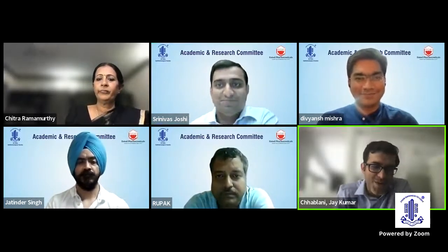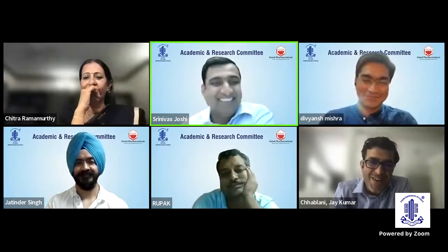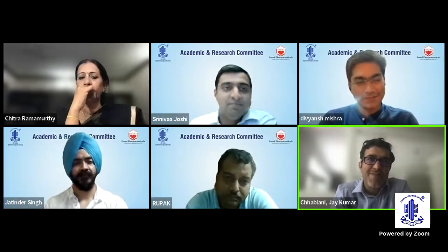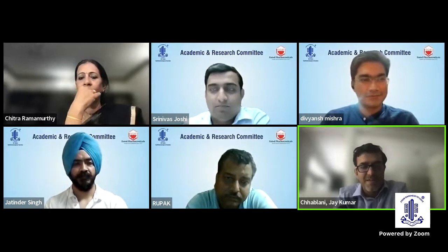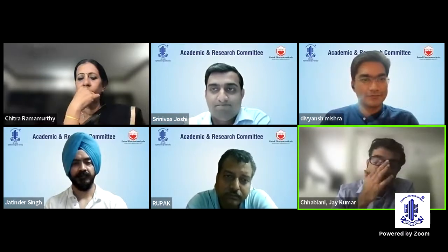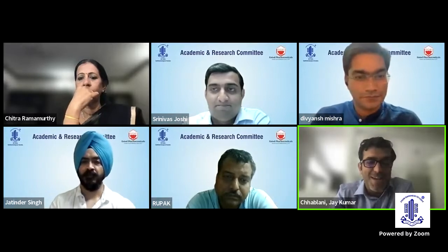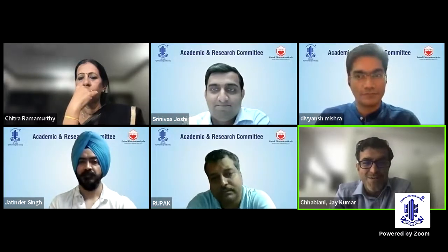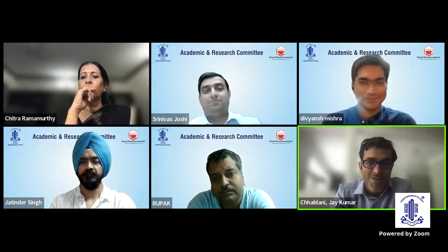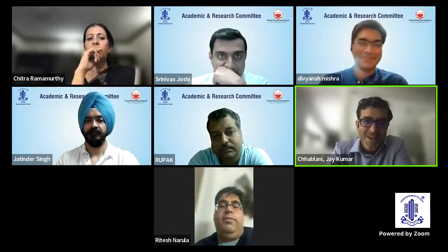I was wondering why do you want to see all 10 layers? You just need 2 layers, right? You just need 2 layers. So pick up SCP and DCP, that is enough for you. But now the segmentation algorithms are superb, and even the Plex Elite provides fantastic segmentation. I think the most important message from Rupak's talk is that OCT angio actually confuses us more, which leads to unnecessary treatment and unnecessary diagnosis. So it's better to follow Rupak's talk and do not diagnose CNVM unnecessarily. That's all I would say.